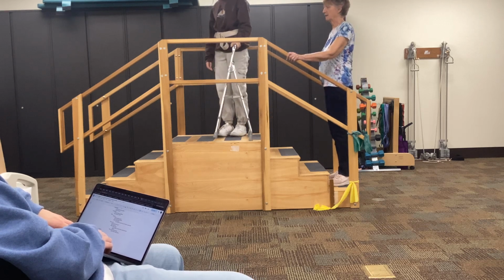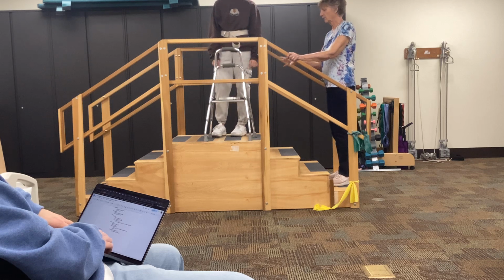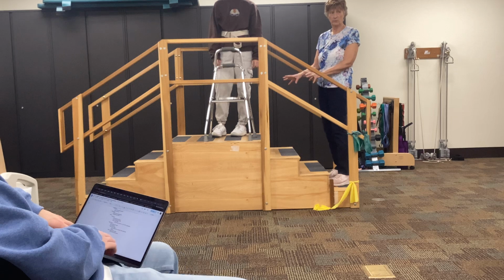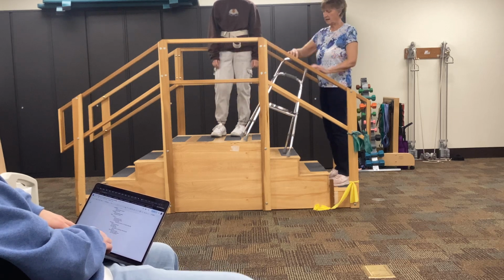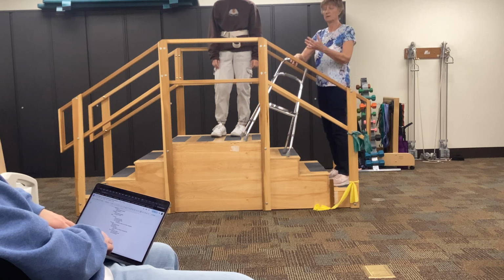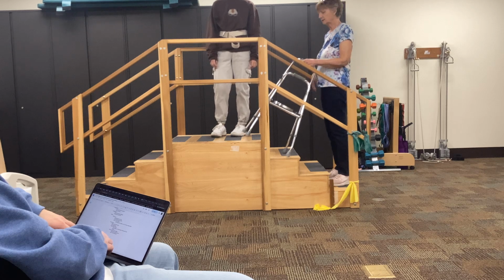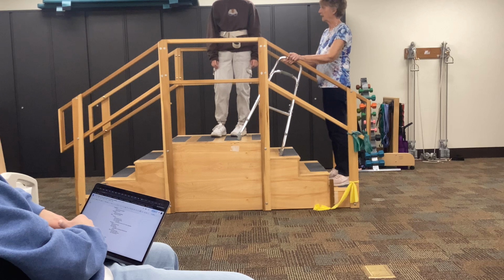Okay, so just like the walker, not really the safest, even though the feet fit better than the walker did. It's still at an angle, and then coming down, her force is gonna be forward. Going up, her force was backward. So still not the safest. Okay, you can look at that.